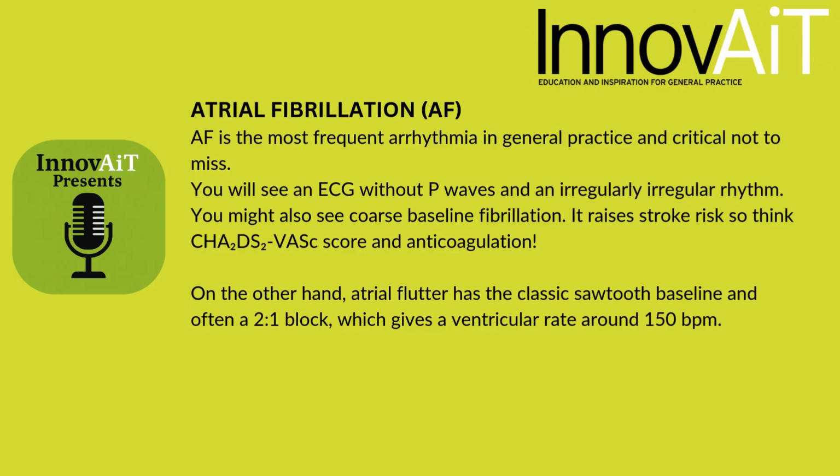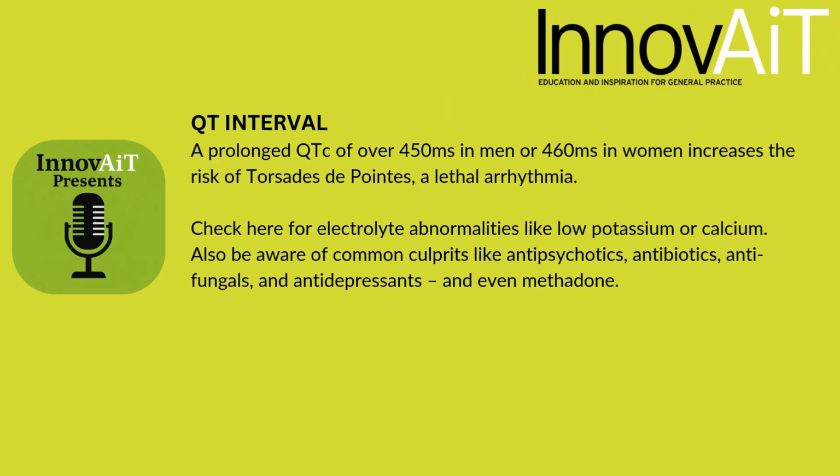Now, the QT interval. Prolonged QTc or corrected QT over 450 milliseconds in men or 460 milliseconds in women increases the risk of torsades de pointes, a lethal arrhythmia.